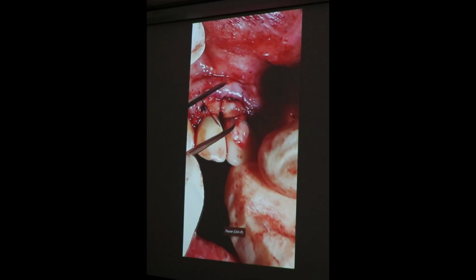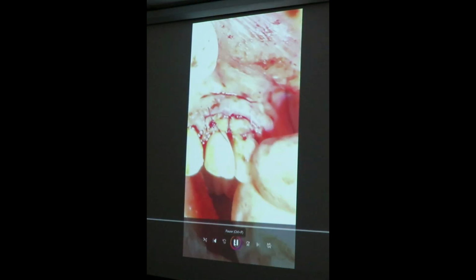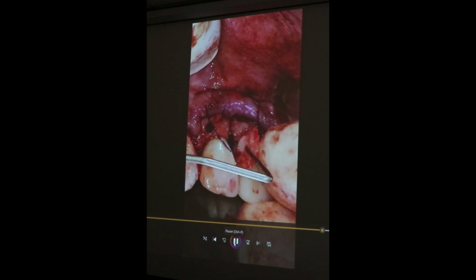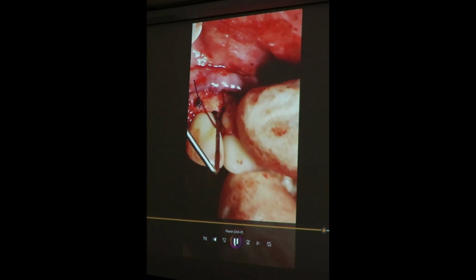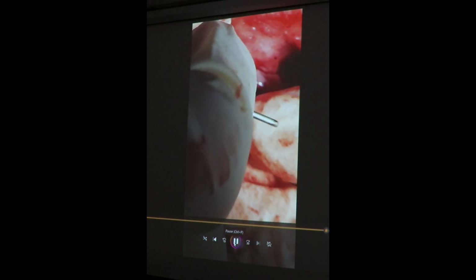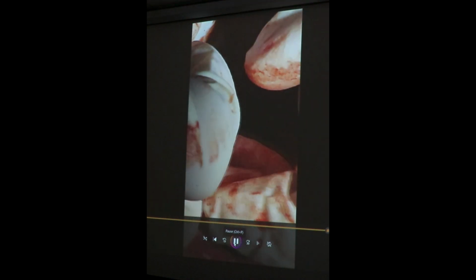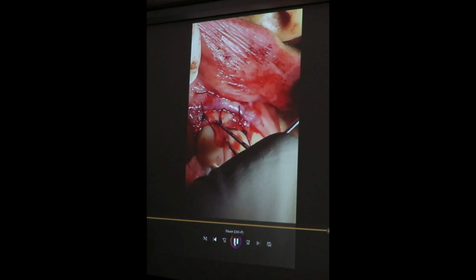You can see it's not going perfectly. We lost a little bit of connective tissue here, but we got what we wanted, because the smaller the pieces, the less chance for the body to accept it. So the thicker, the better. But again, back to Zucchelli, because it's 1 millimeter, it's very difficult to control. In the olden days, we used to use as thick as possible. Now it's not like that. Now we're going with 1 millimeter or even less than 1 millimeter.